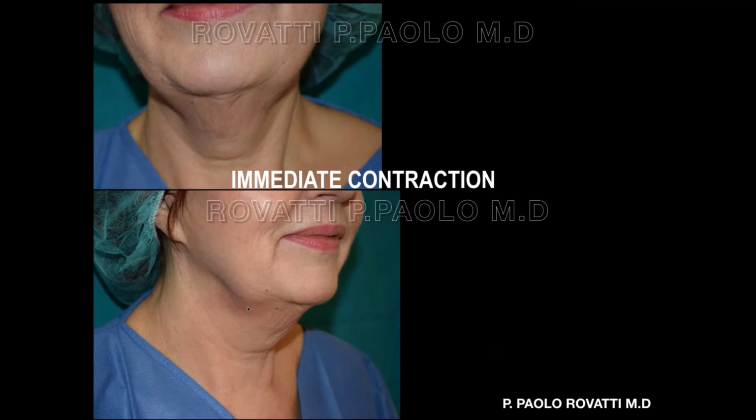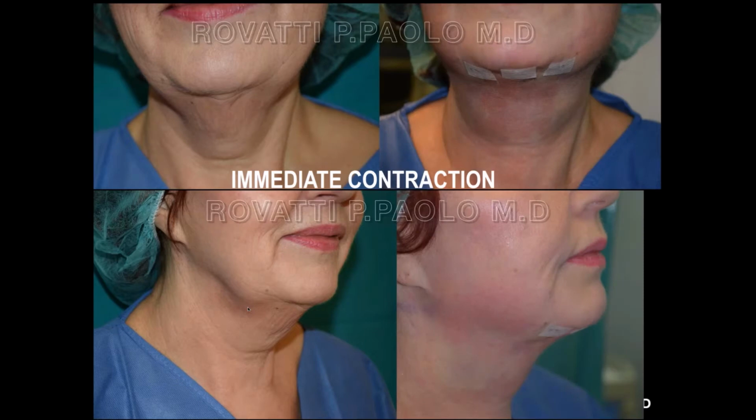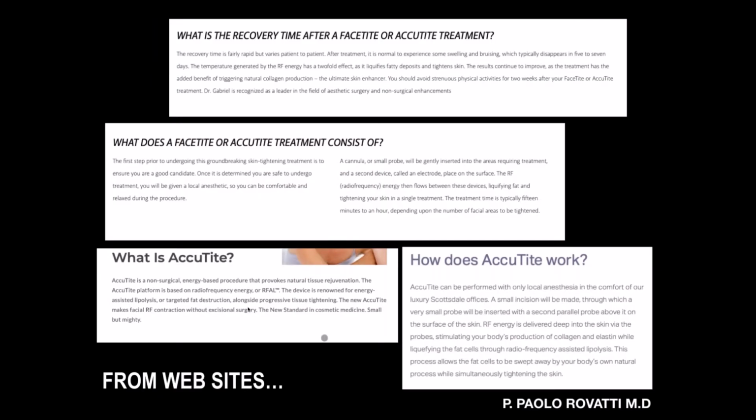This is immediately post-op. You can see the neck has less volume and a great contraction of the tissue. And again, what I see on some websites, I see liquefied fatty deposit, liquefied fat cells, targeted fat destruction. Well, maybe it is right that this is fat destruction, but we don't want to destroy fat. We want only to have a contraction.